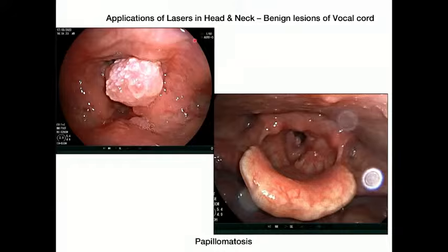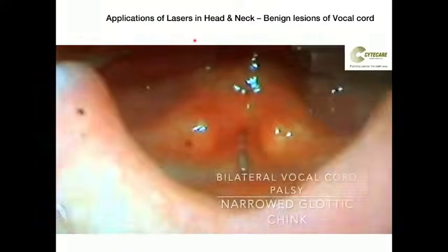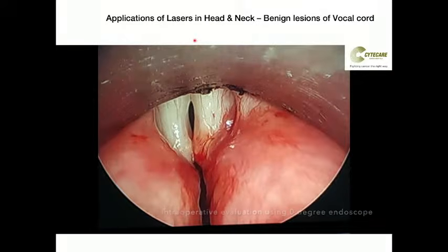When you have laryngeal papillomatosis, it's not just laser. What you need to do is use a laryngeal debrider. Debride the tissue, because laryngeal papillomatosis is limited only to the superficial layer. You don't have to do extensive excisions, right? What you want to do is completely debulk to the surface and then use a defocused beam laser for the surface, because these patients are going to recur, and every antiviral injection does help.